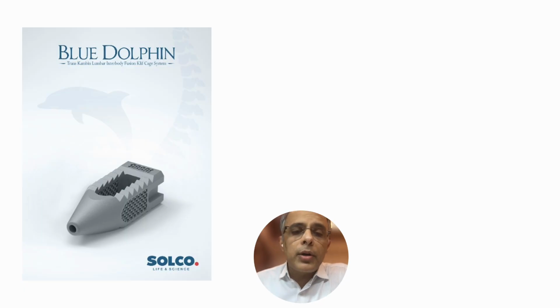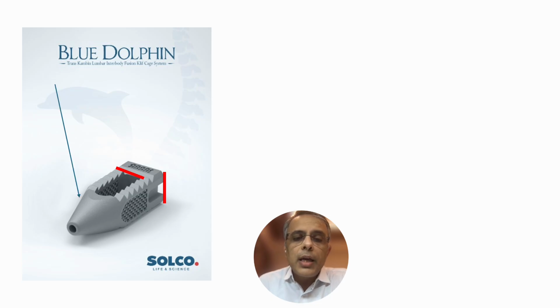Now if we talk about the cage, this is a Blue Dolphin cage designed by Solco, and you can see that this is the height of the cage, this is the width of the cage, and this is the conical tip of the cage. Now all these three things are very important to remember. Let us take them one by one. First we take the conical tip.